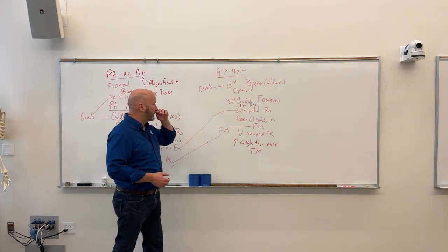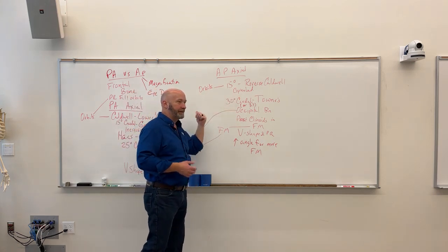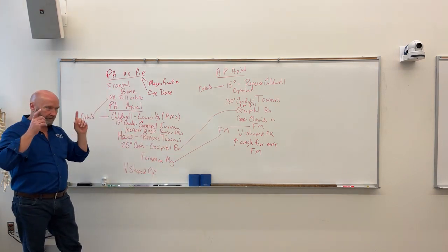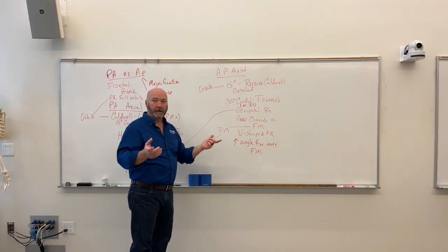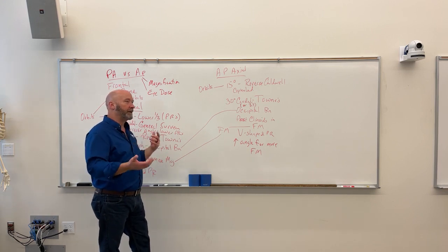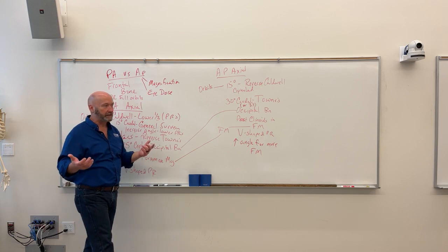All right, so also with the AP of the Caldwell, the only difference between the AP and the PA is loss of sharpness recorded detail in the orbits and the magnification of the orbits, right? Everything else is identical. Entrance point and exit point notwithstanding, what you see is the same.